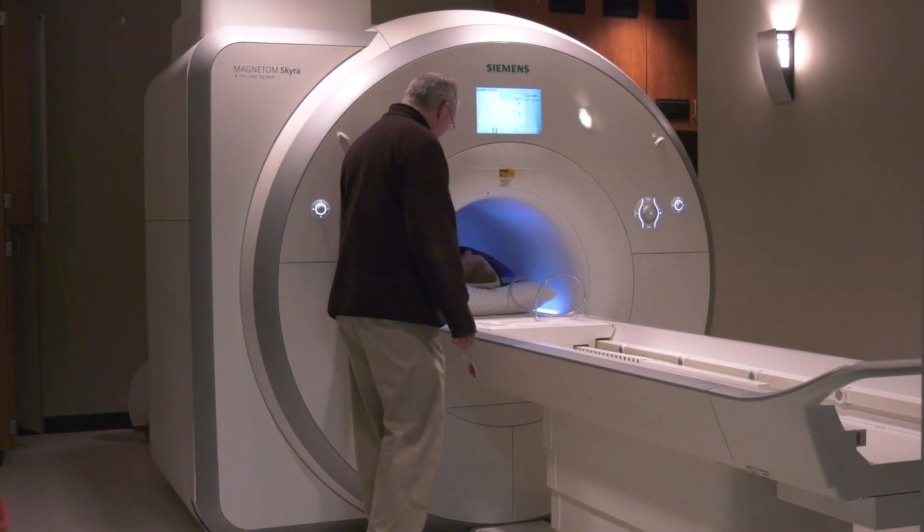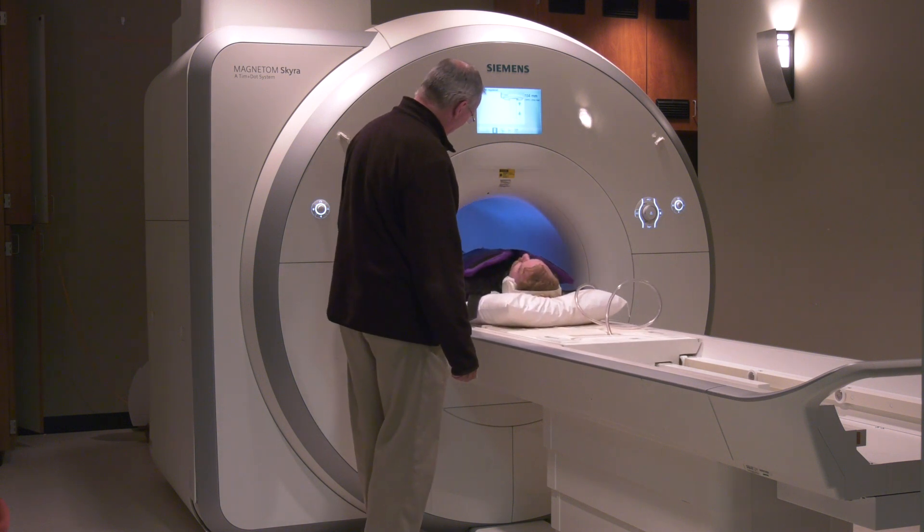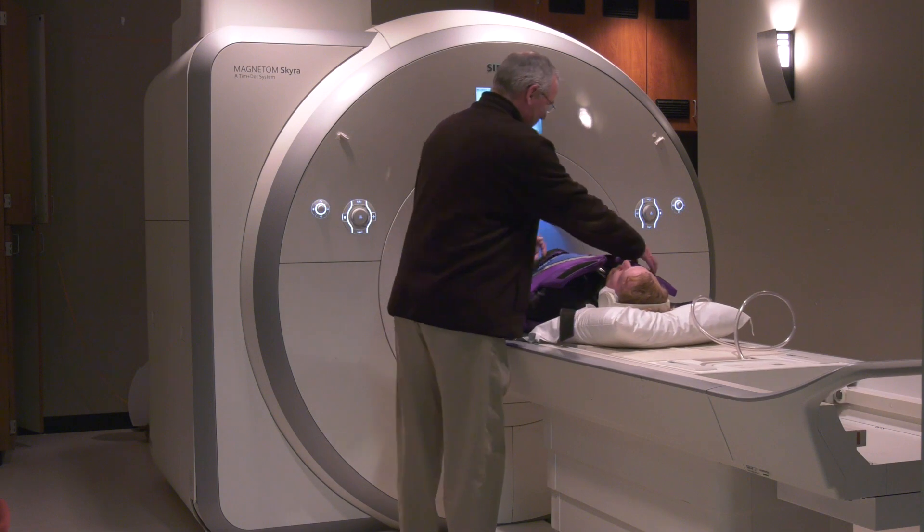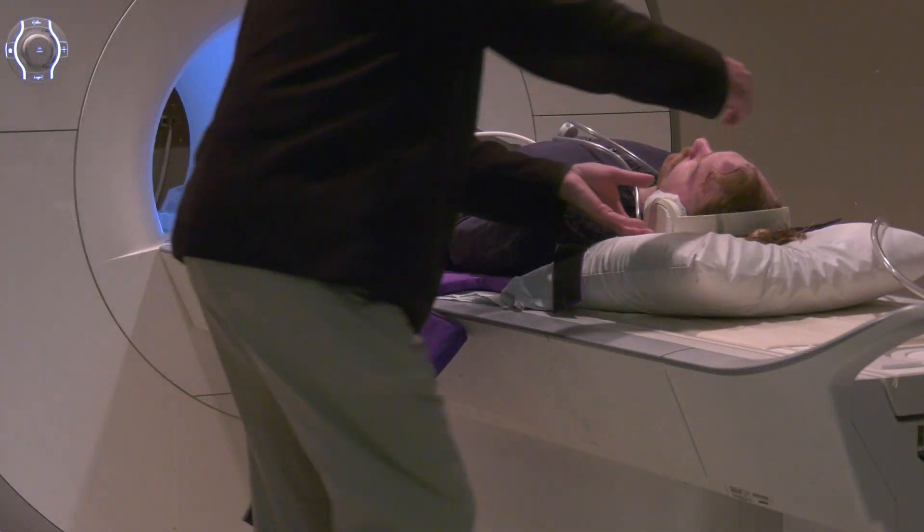Once all images are taken, the participant can come out of the scanner. Participants are usually in the scanner for a total of 20 to 30 minutes, varying based on the study.